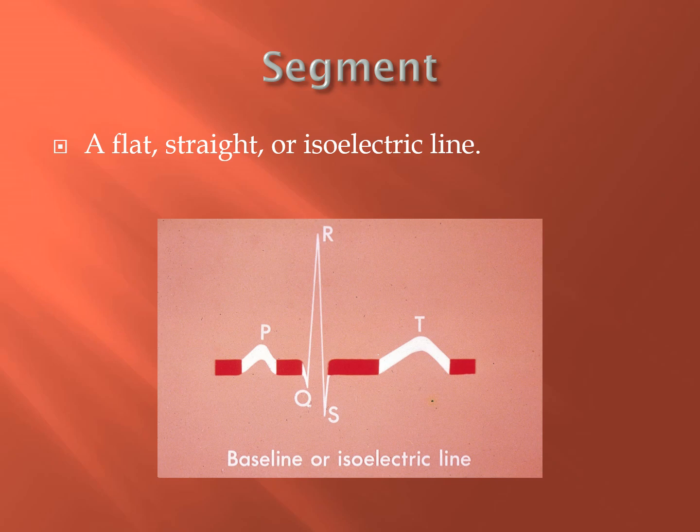A segment is a flat, straight, isoelectric line, which is what we're looking at here.